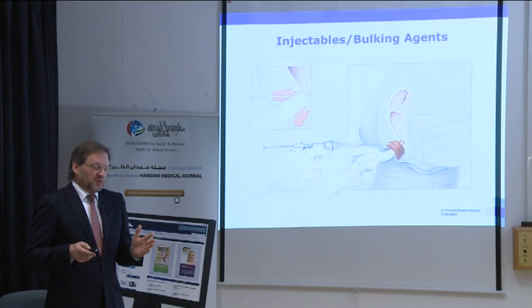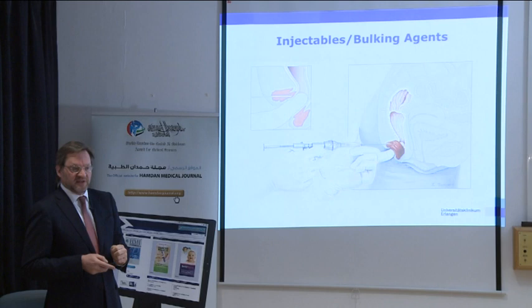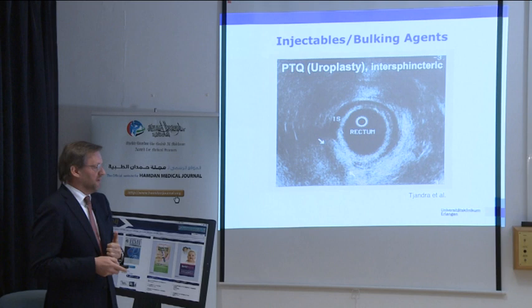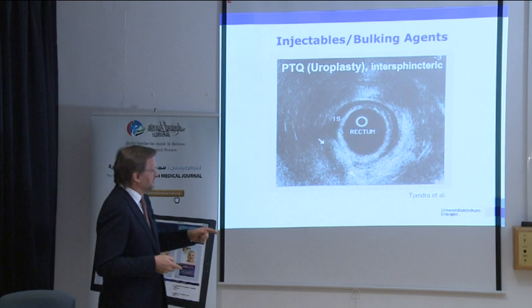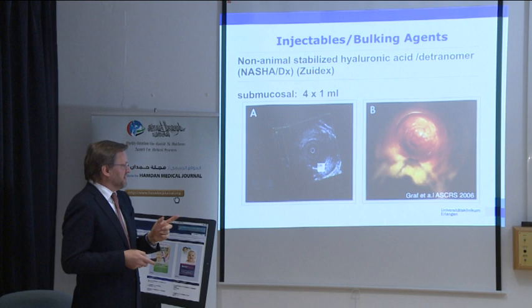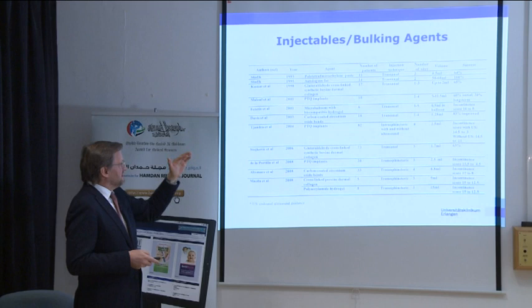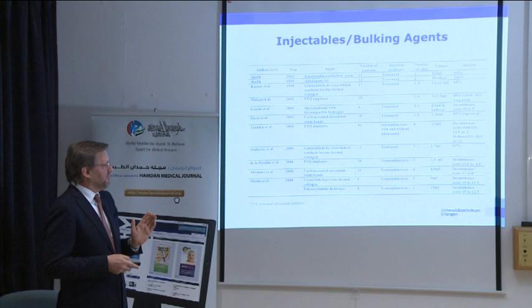There's a clear trend towards less invasive techniques, which even can be applied in an outpatient setting, like the posterior tibial nerve stimulation. The injection of bulking agents has recently got some attention. It's not a new thing, but recently there are new substances around and new ideas how to best apply the substances. This is just an example of a transanal application of a substance which initially was used in the cosmetic industry, and the results have recently been published in the Lancet. This is an overview, though the technique is not as new. It's been around since 1993, but various substances with marginal success were reported, but there seems to be a change with this new substance coming in.